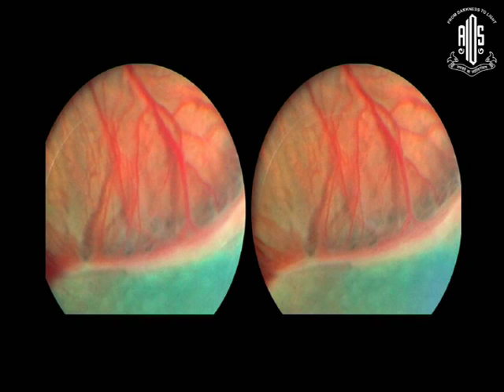Till this technique came up, and I must say these are probably the first stereoscopic images taken in retinopathy of prematurity. And this was taken with this humble technique of a lens and a smartphone. And you can see the quality of the images. RetCam cannot take this detail because RetCam is a wide angle imaging system. It's not designed to take detailed fundus pictures like this. So this is a great advantage of this humble technique.